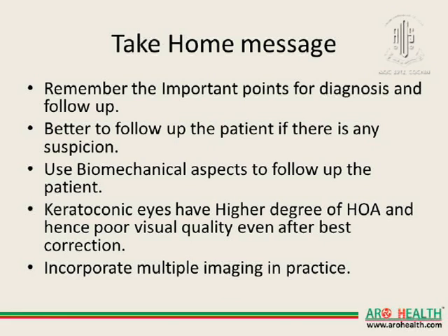Now, the take-home message: you should remember the important points for diagnosis and follow-up. It is better to follow up the patient if there is any suspicion. Use your biomechanical assessment to follow up the patient, that's very important. Keratoconic eyes have a higher degree of aberrations and poor visual quality even after best correction. It's better to incorporate multiple imaging practices if you can.